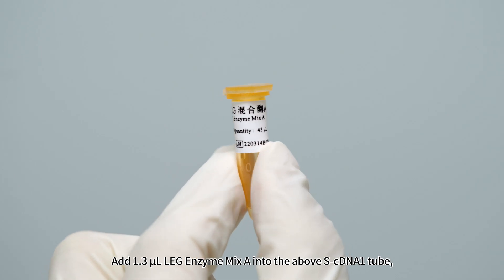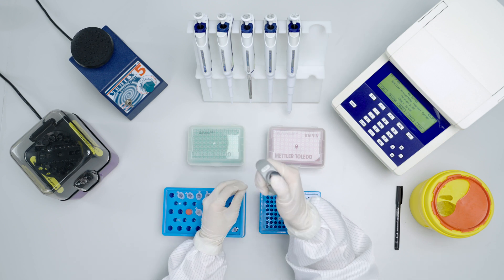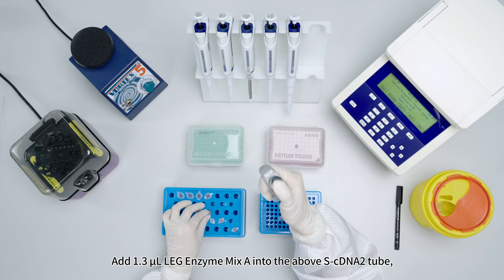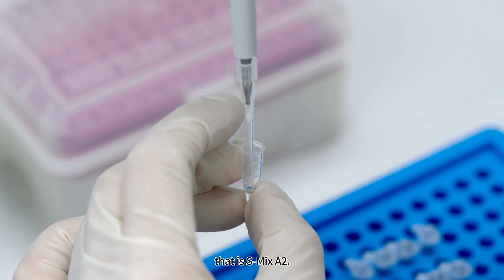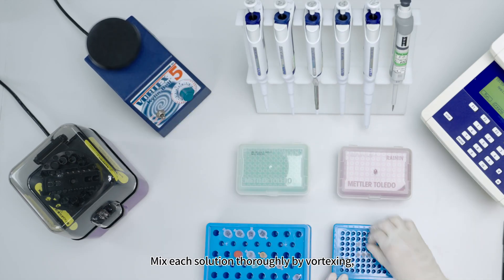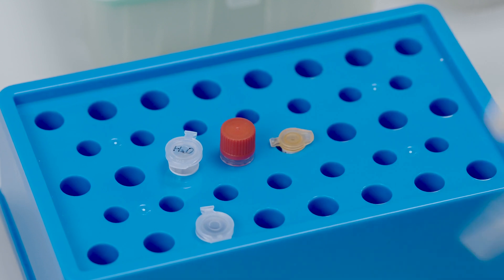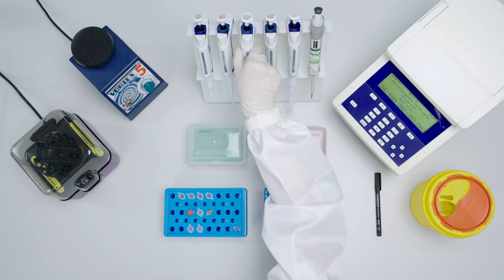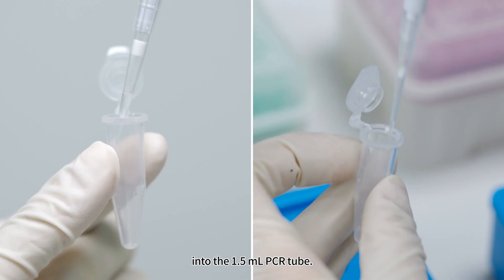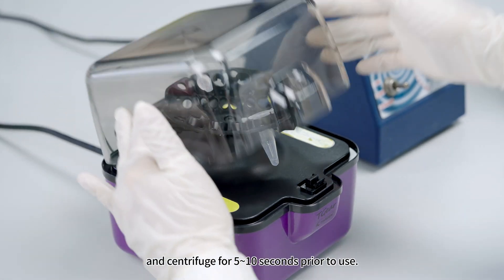Add 1.3 microliters LEG Enzyme Mix A into the cDNA1 tube; label it S-Mix A1. Add 1.3 microliters LEG Enzyme Mix A into the cDNA2 tube; label it S-Mix A2. Mix each solution thoroughly by vortexing and centrifuge for 5 to 10 seconds. Add 45 microliters nuclease-free water and 2.3 microliters LEG Enzyme Mix A into a 1.5-milliliter tube and label it N-Mix A. Vortex and centrifuge for 5 to 10 seconds.